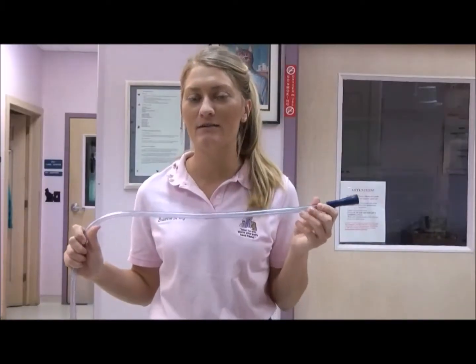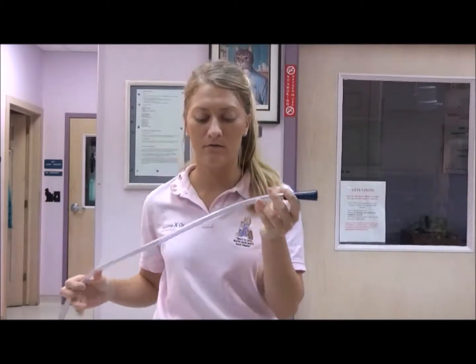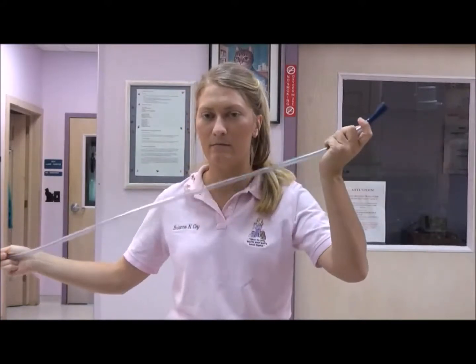For gastric intubation, you'll want to measure the tubing from the mouth of the patient to the back of the last rib. So it's similar to an esophageal stethoscope in that the tube will travel down the esophagus, but instead of stopping in the thoracic cavity in the esophagus, the tube will extend beyond that into the gastric area, into the stomach.